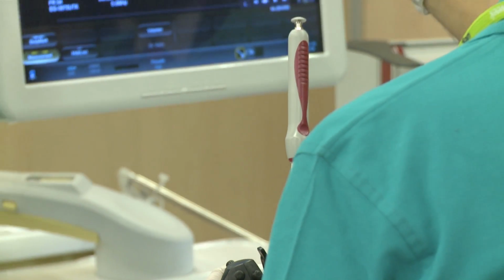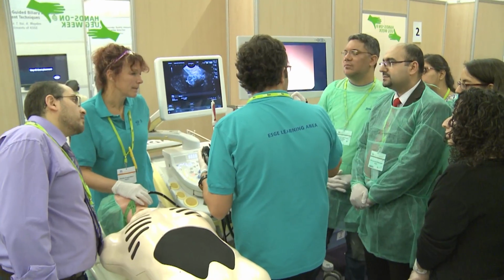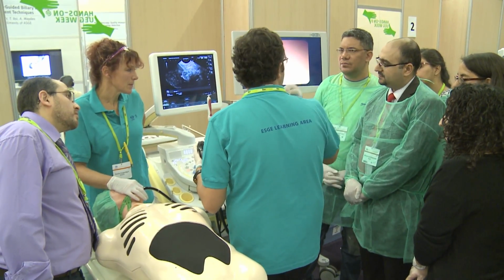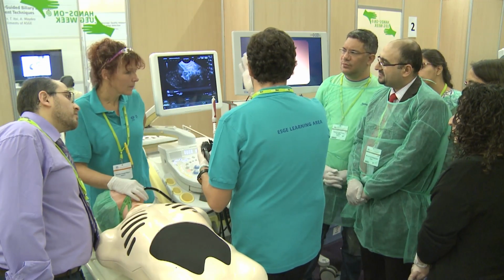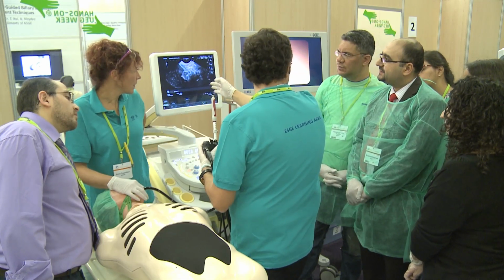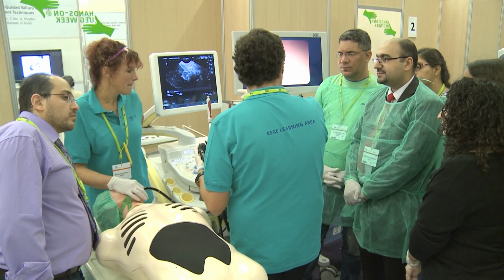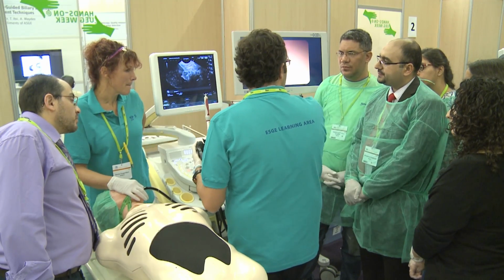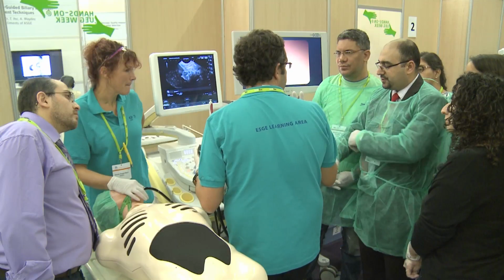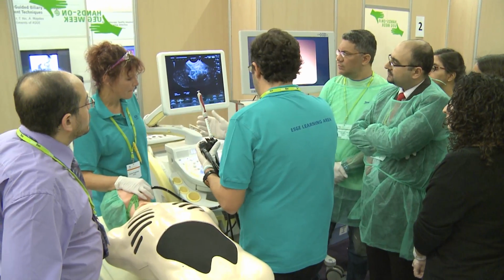Honestly, this is useless, because this is completely visually directed. Exactly. So there is no moment like in a percutaneous biopsy that you do not really see. In this moment, you are always going to see the needle. And if you do not see the needle, stop. Come back and redirect again. Exactly. Because although it seems that you can only go in one direction, there is like 1 centimeter difference at the very beginning. That means that if you go 1 centimeter to 1 centimeter, there can be like 2-3 centimeters of difference from what you see. This is a 2D image, but we need to have a 3D image in our head. Okay? So I never use it because I want to have the capability of feeling it free.